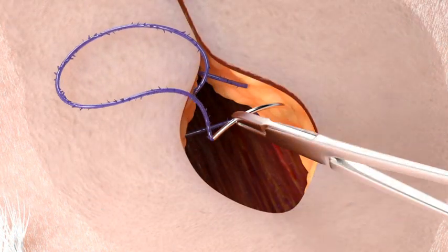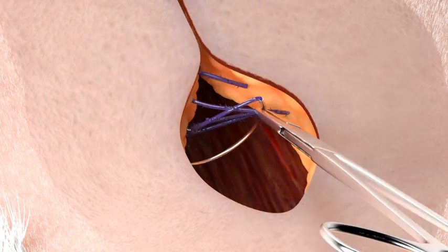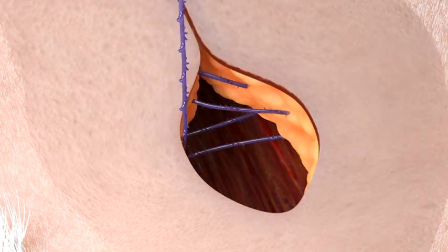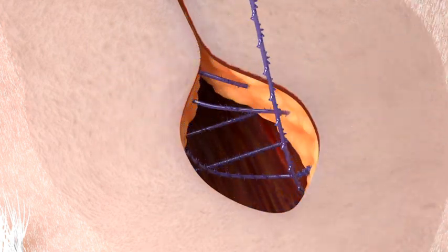You then engage the other arm of the Quill device and continue to close the remaining half of this same layer. Do not backstitch and cut this arm of the Quill device, as this arm will be used to close the more superficial layer.